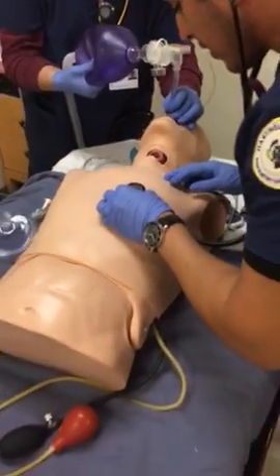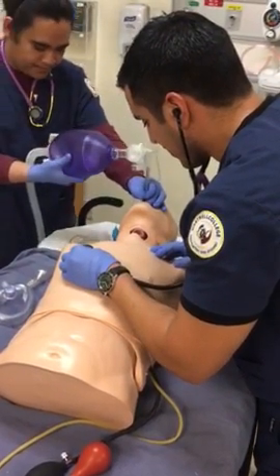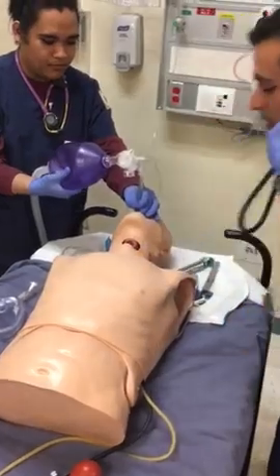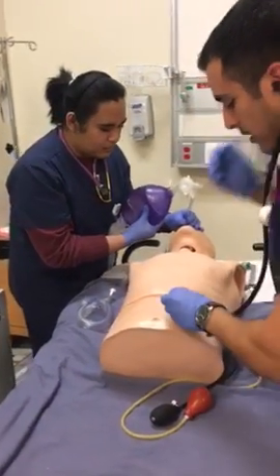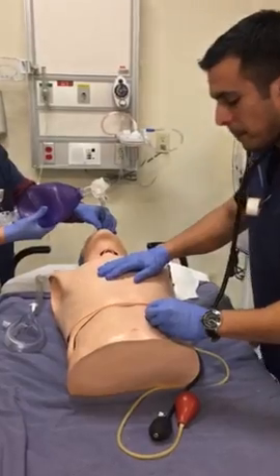I'm going to listen to lung sounds. I can hear equal aeration on the left and right side. I could also listen to the stomach and make sure I don't hear any aeration going into the stomach.